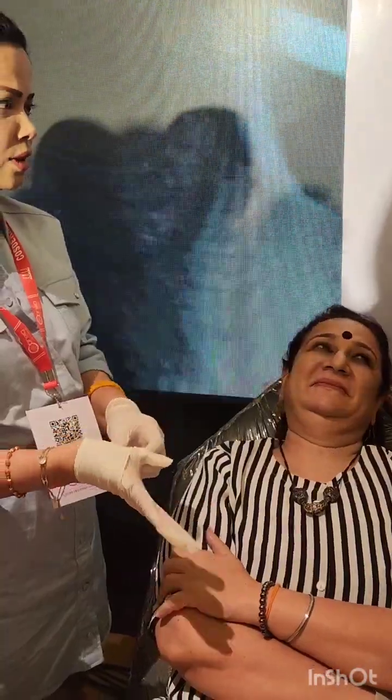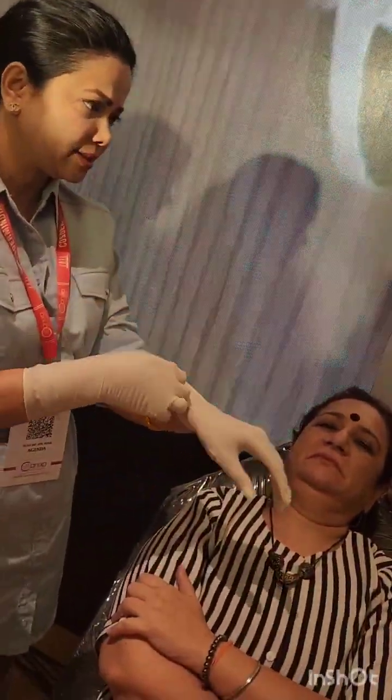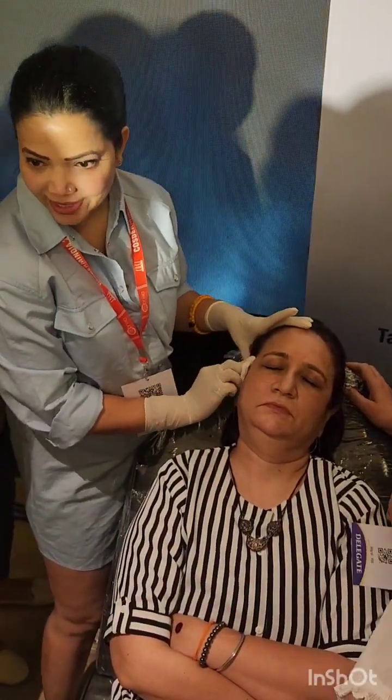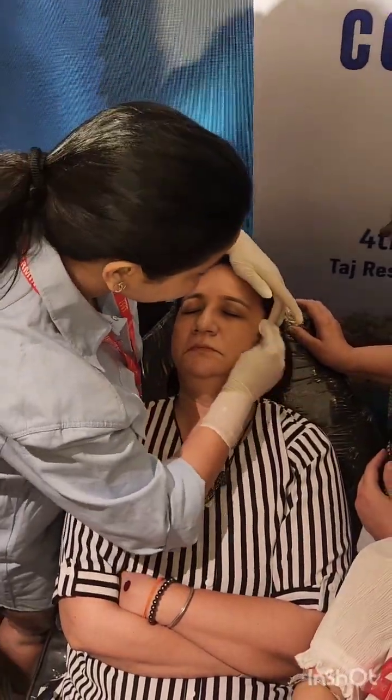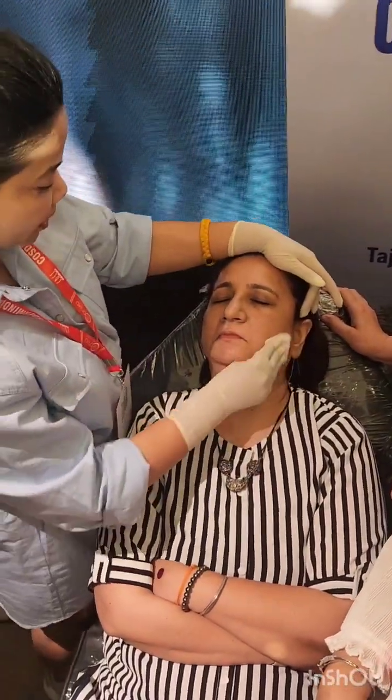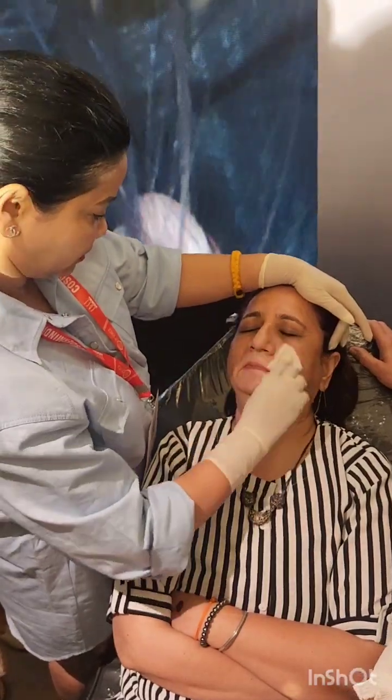No, 6 months. Easy rejuvenation because that gets diluted, hydrolyzed in 6 months. You have to anesthetize because we are going deeper. So whatever entry point is there, take the marker.